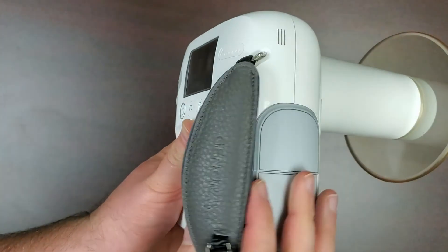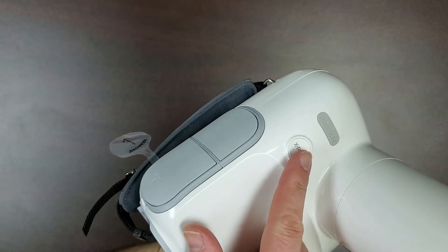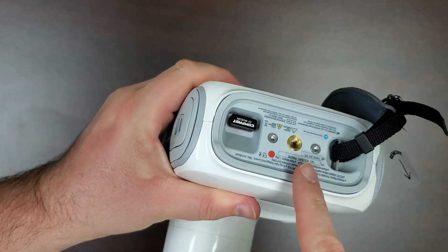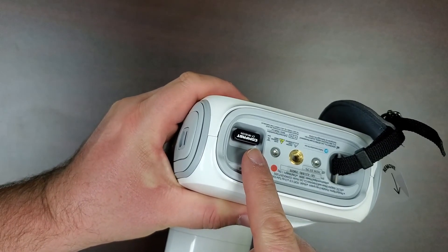The other side of the unit contains the battery slot and the front of the unit has the exposure button. Finally, on the underside of the unit is the tripod mount and the USB slot for your wireless dongle.